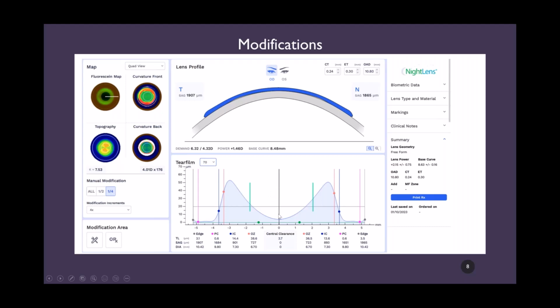So let's look at this slide right here. When I said you don't want to change the base curve of the lens, I mean you don't want to change this curve. Why? Because changing the base curve changes the amount of treatment that you have over the apex of the cornea, but it does not affect your fit. Think of the term alignment curve. Alignment means how does it align with the cornea?